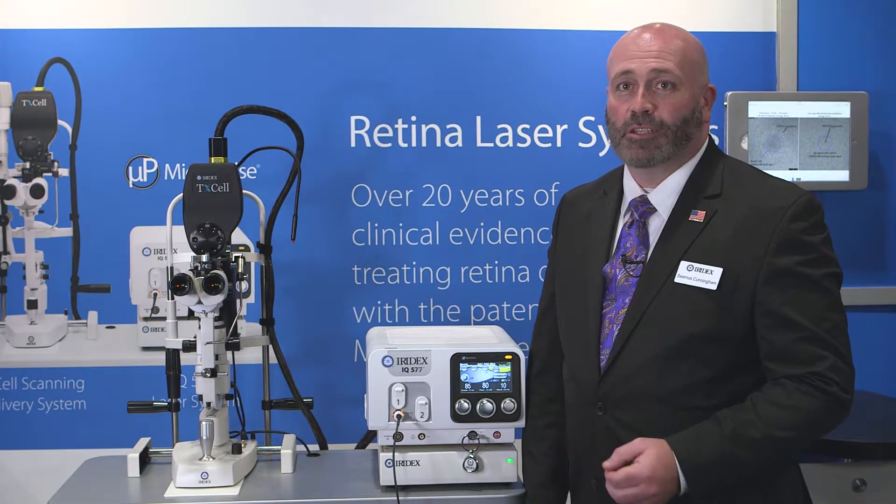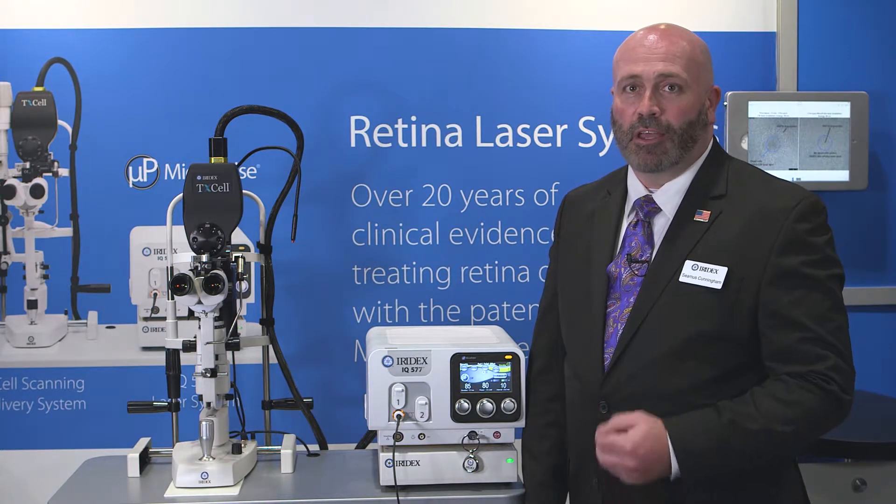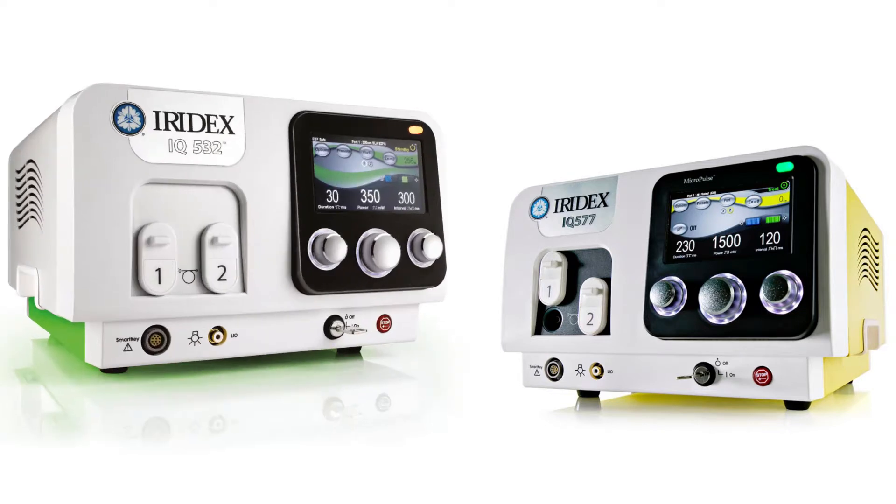Hi, I'm Seamus Cunningham and I'm an Area Sales Manager with Iridex. Today I'm going to go over the programming of the IQ577 and IQ532 lasers.